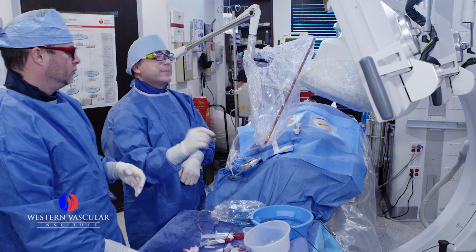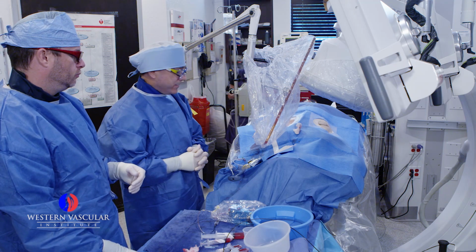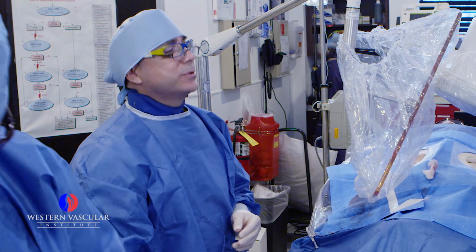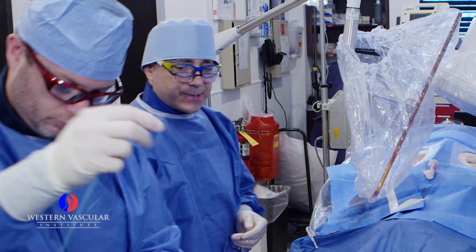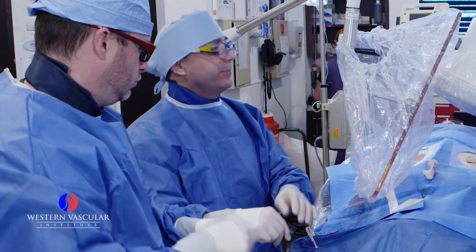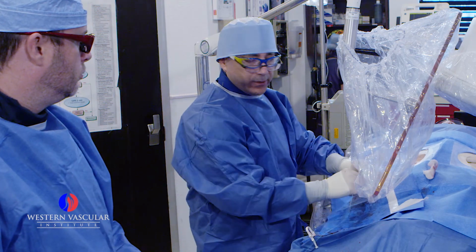A lot of times the laser will make the picture look funny, so I do like to use a balloon to kind of shape the artery so that the plaque doesn't fracture and we get a better angiographic result. And to really get a good idea of exactly how the angioplasty worked and the laser worked, you really do need to use just a little bit of dye. So we'll use a little bit of dye here to take a picture and see what we're dealing with. If it doesn't look good, we'll put a small stent in there. If it looks good, we'll leave it alone.